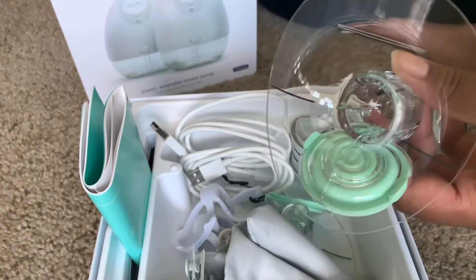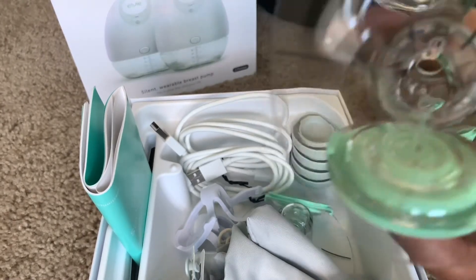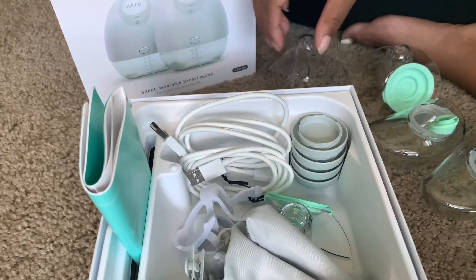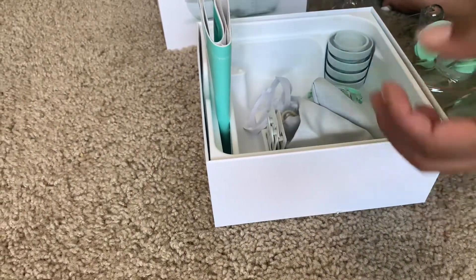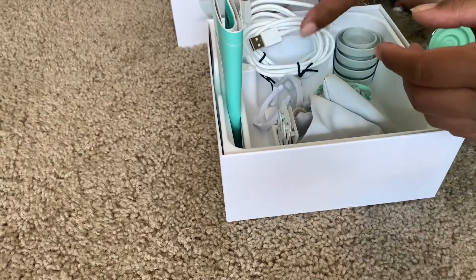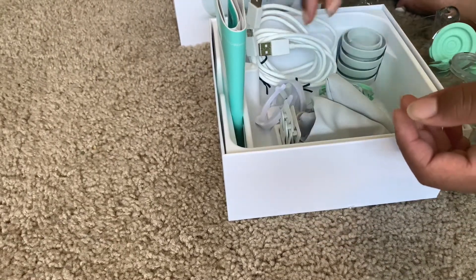They give you the flanges — both the 24 and the 28 sizes come in the box. This is the 24 size and this is the 28 size, which is absolutely great. You also have your chargers because you have to charge the Elvie pump, and the lids for storing your breast milk in the black plastic bottles.